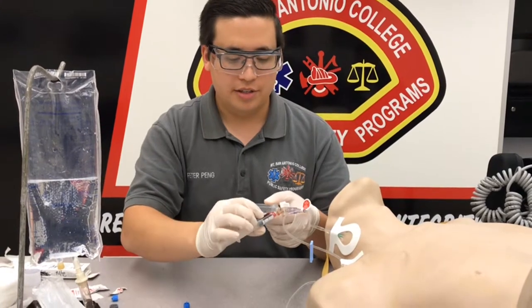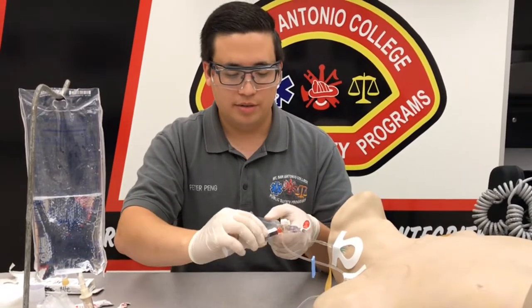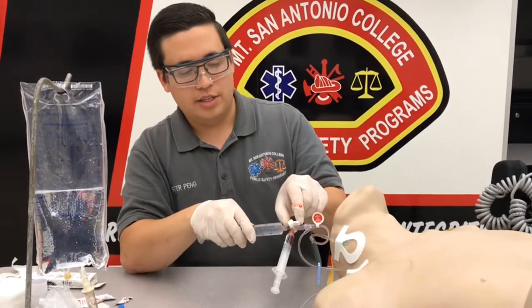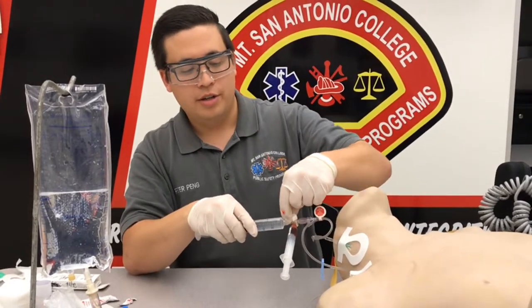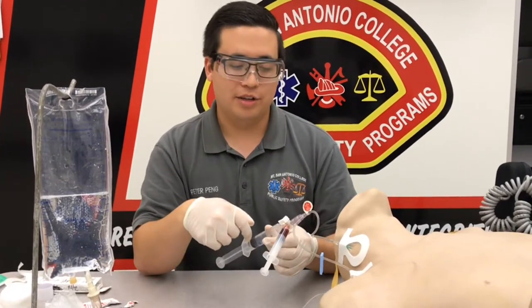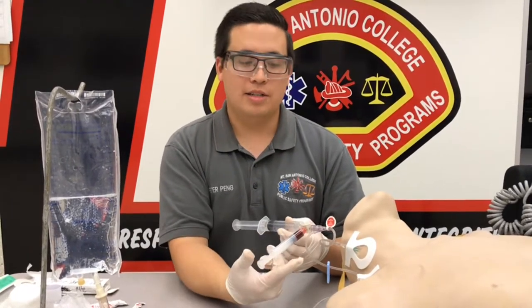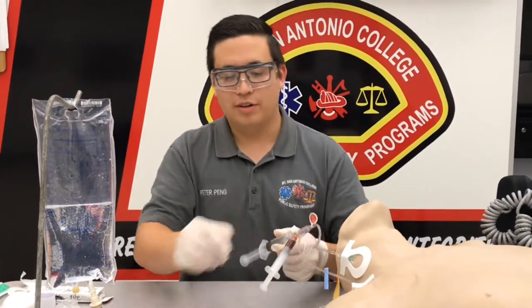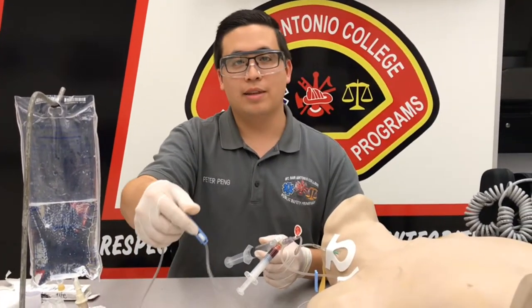I added some red dye just so you can see the medication actually being pushed. Now at this point, we want to close this back off to the flush — that way we don't have to pinch anything and we don't have to worry about it backing up into the flush. We can just slam the adenosine, switch this over, and then slam the flush. No pinching involved. The only thing you need to make sure is that your main line is closed off.